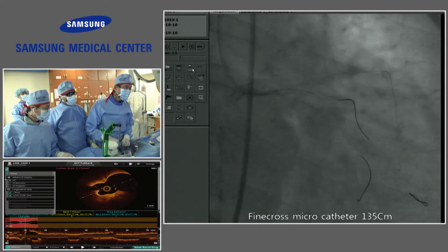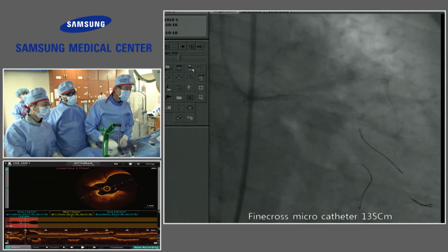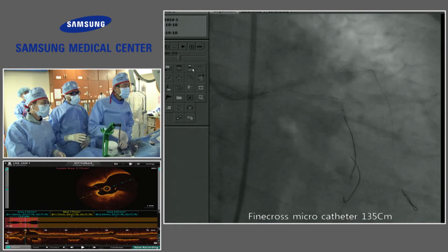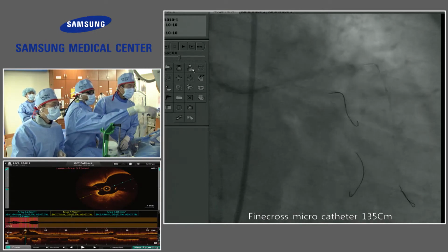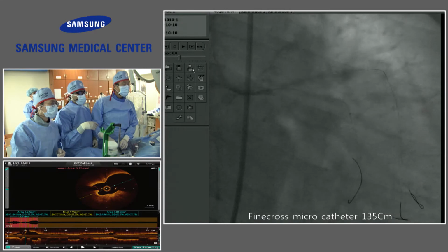I may be able to tell by the behavior of this wire. Okay, not too far back. Okay, this way. So that's good, right? So we're going into both branches. But this is the branch, and we are going that way. So you think we're this far back? It's a different view. This is the better way to go. Yep, good.